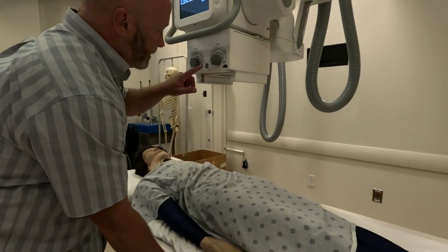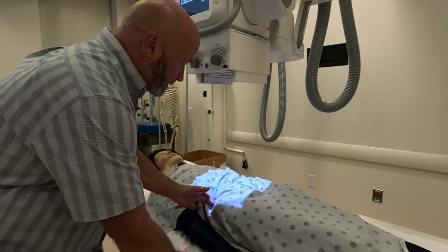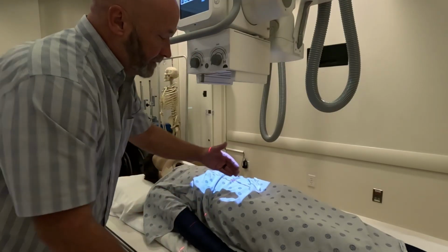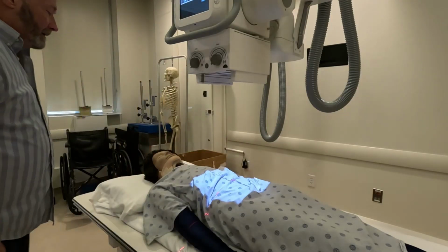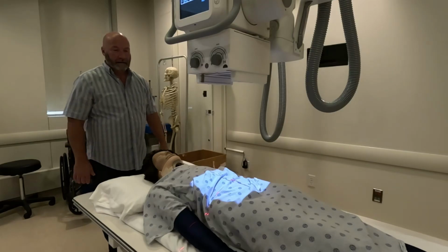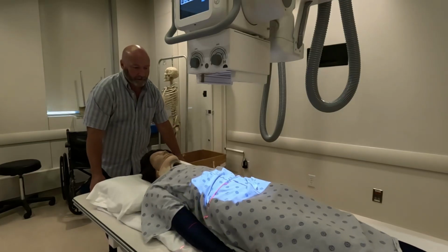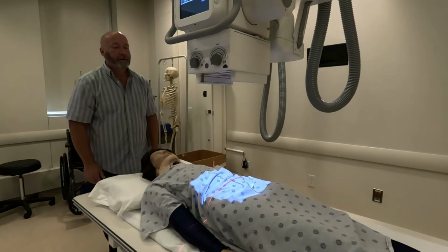So you push the pedal, and if we're shooting an abdomen, I'm going to center at the iliac crest with this line of collimation. That line of collimation is going to go straight down the patient's body. Until you really get good at it, what I would recommend is get at the end of the table and take a look and make sure that the patient's not on the table a little bit crooked. Sometimes that can kind of fly right past you.